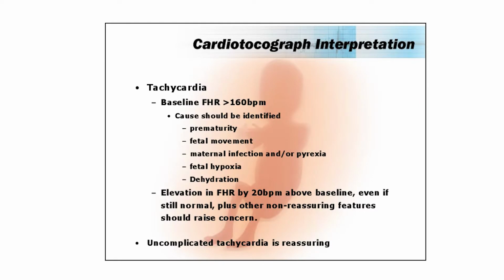Some infants will respond differently to other infants to changing circulations of blood oxygen, carbon dioxide, lactate, than the same infant at the same gestation exposed to the same insult. It's unpredictable. So having criteria to interpret is going to be very difficult for the severely preterm infants.